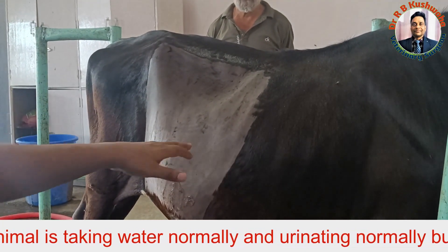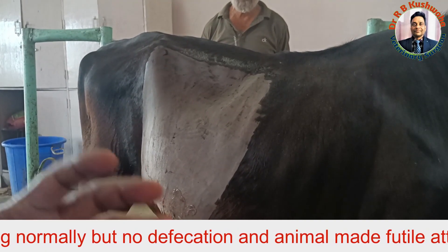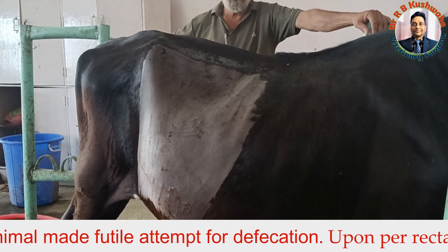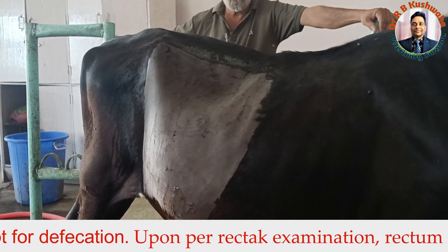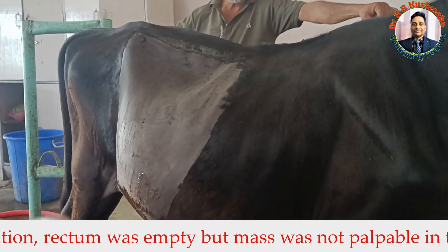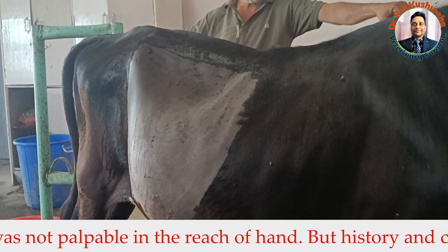In such cases, if you want to confirm 100%, ultrasonography is very helpful. Although from ultrasonography we may not be able to trace the bull's eye pattern or exactly locate the intussusception mass, in intussusception there is distension of the anterior segment of the intestine. So if we perform sonography and find distended loops of intestine, we can definitely suspect intestinal obstruction or, indirectly, intussusception.